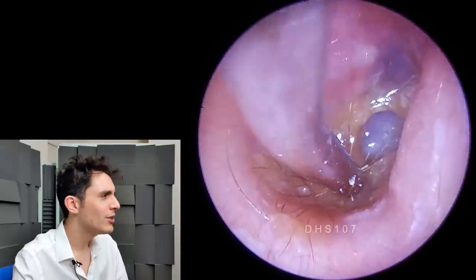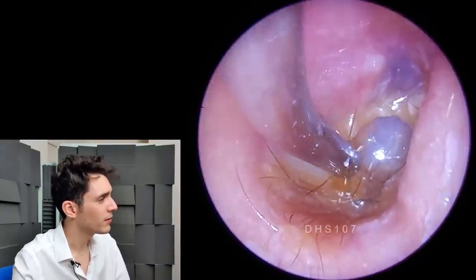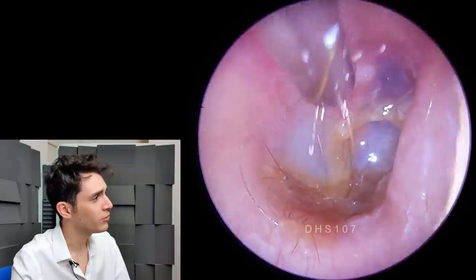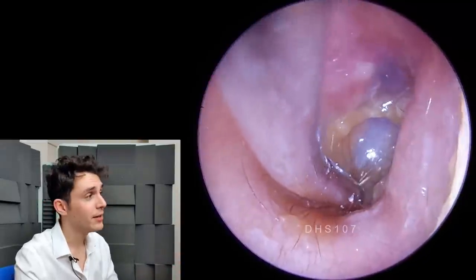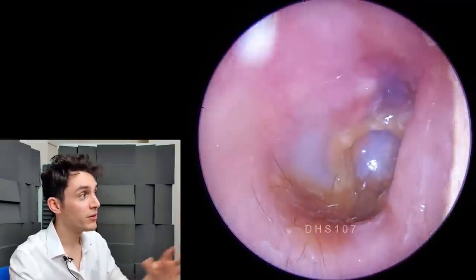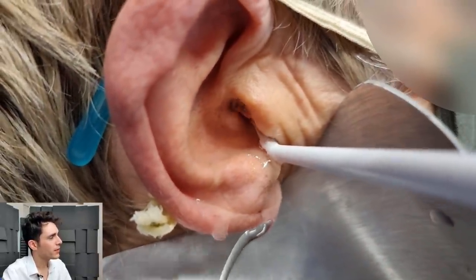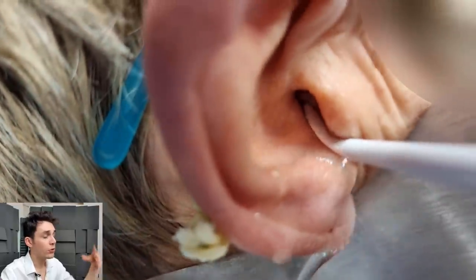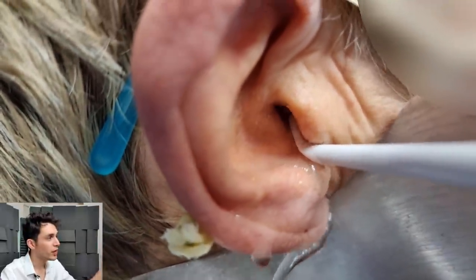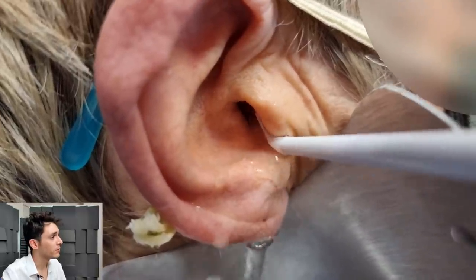The patient is reasonably tolerant of this, but it's not like they're loving it because we're that close to the drum. You can see just how clear the ear canal is now, which gives me much more confidence because I know the space I'm working in. One more round with the Guardian Projet on its lowest setting. The water is just swirling down and gently washing that slime out of the trench, out of the inferior recess.